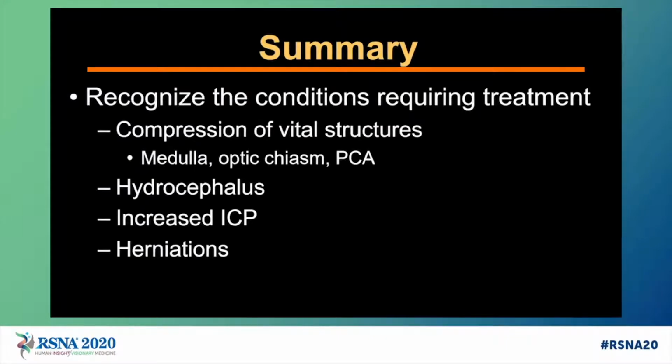I think that perhaps even more important, particularly in the acute setting, is to recognize the conditions requiring treatment, such as compression of vital structures. And I've shown you compression of the medulla, compression of the optic chiasm, and that case of compression of the posterior cerebral artery. Certainly, you want to report hydrocephalus because the patient may need to be emergently shunted, and you want to recognize the signs of increased intracranial pressure, particularly when they lead to herniation.